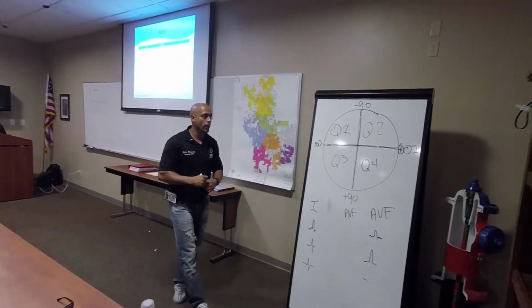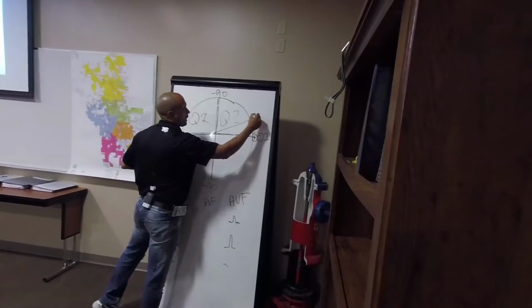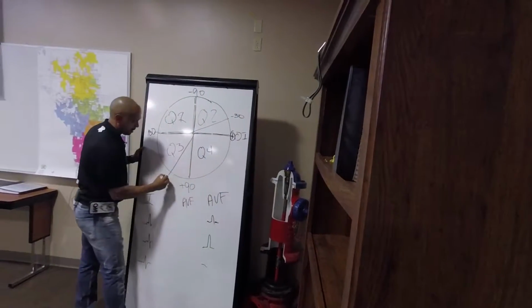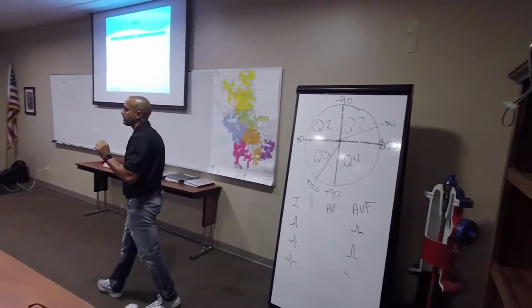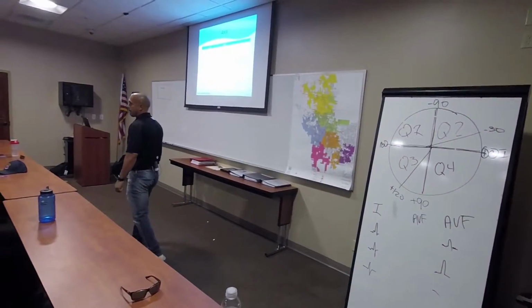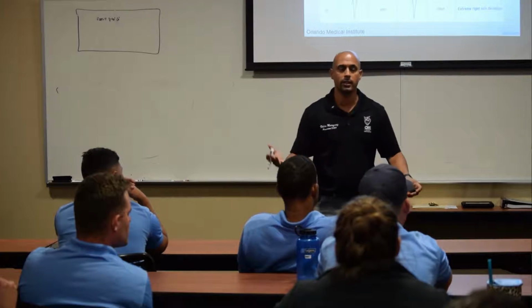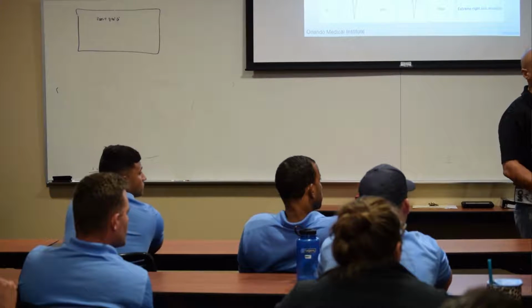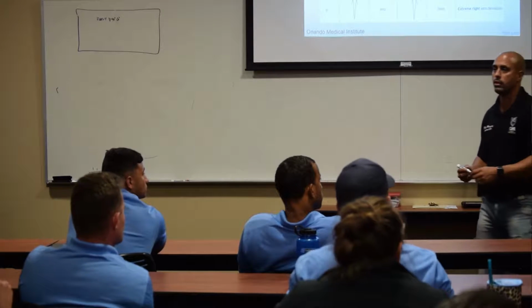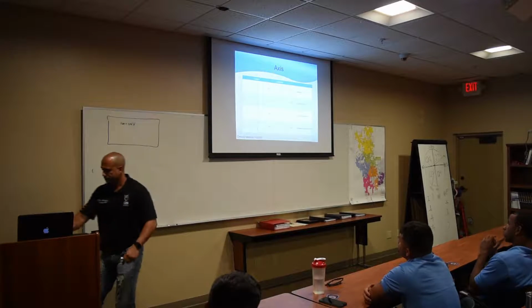I just use a rough rule. If you want to know the exact deviation, it's actually negative 30 to positive 120. That's the exact axis to be considered normal. But you rough rule it. Rough rule is cool, that's what we do. So just remember 0 to 90, that's fine. But if you're that person that needs to know the exact, negative 30 to positive 120 is considered normal deviation. Everybody with me so far? All right. So we move on.